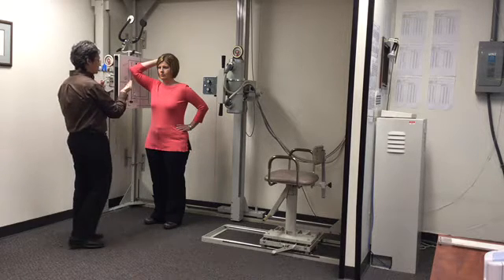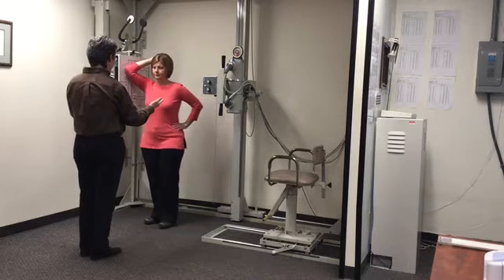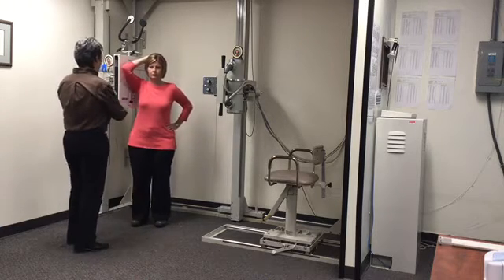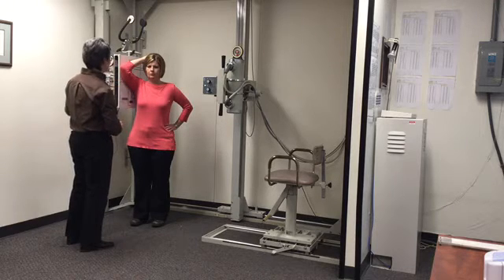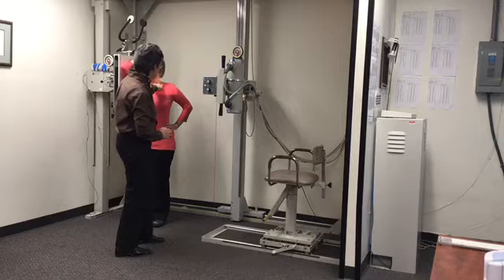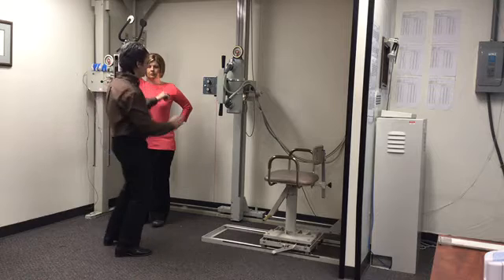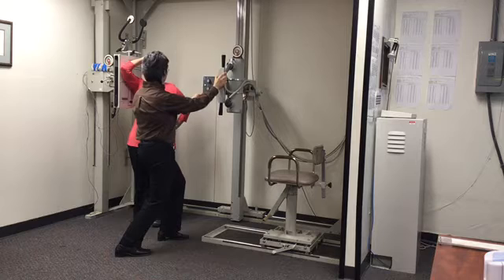So at this point, what we're going to do is have the patient turn at about 45 degrees towards me, if you would. Okay. Great. We're going to have her step up against the bucky until the back of her arm is against the bucky, and the shoulder blade will also touch as well. Okay. So next thing we need to do is position the beam so that it is at the midclavicular line. So again, that's down low into the neck at the C7T1 level. So if we have to raise or lower our tube to see where our beam is, we're going to go ahead and get that horizontal beam through the midclavicular line.